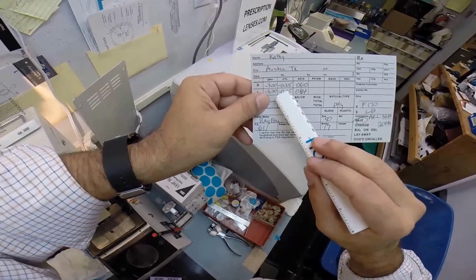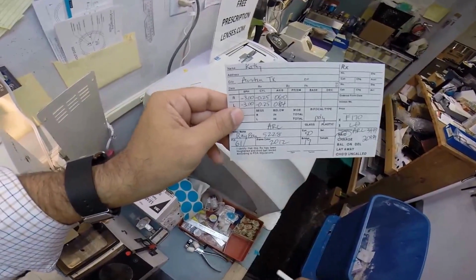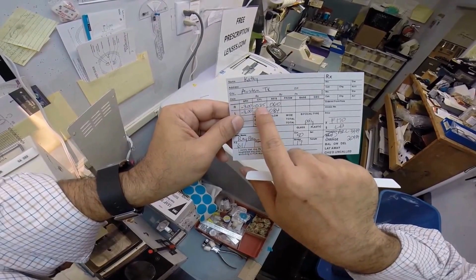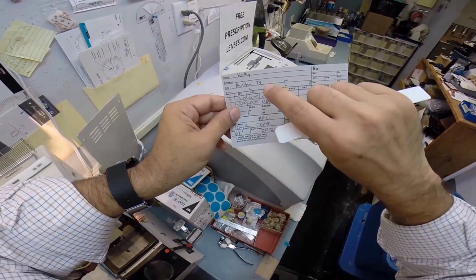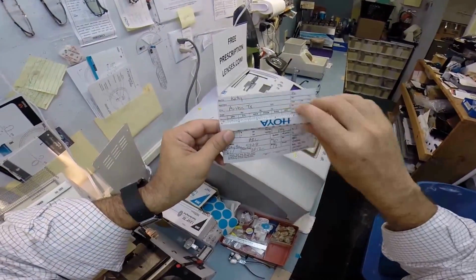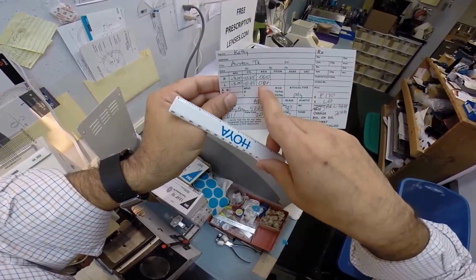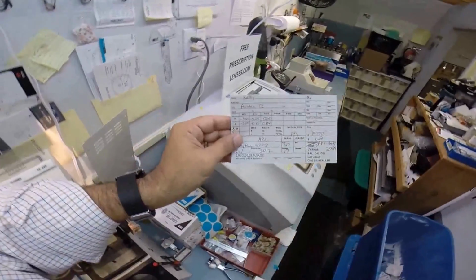So this first number gets everything the correct size. The second number takes away fuzzy edges. Astigmatism is what makes 6s and 8s look alike, the letters P and F. So this first number gets everything the correct size. This one takes away the fuzzy edges. Think of it as the fine-tune knob, and that fine-tune knob we're going to turn to 60. On a straight line is 0 to 180, so we're going to turn that just past the 45 meridian to about 60. We're stopping well short of the 90 meridian, so we're about 60. Now the left eye, same powers as both, but we're going to turn that knob to 84, which is just before the 90th meridian.